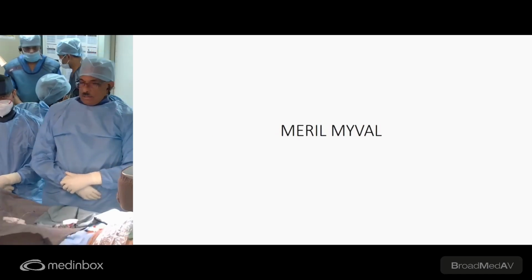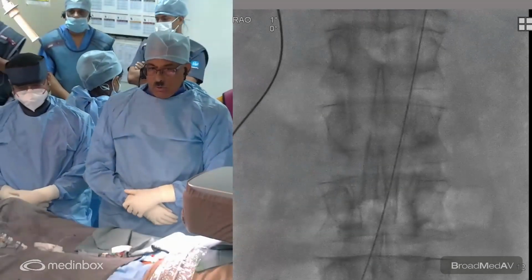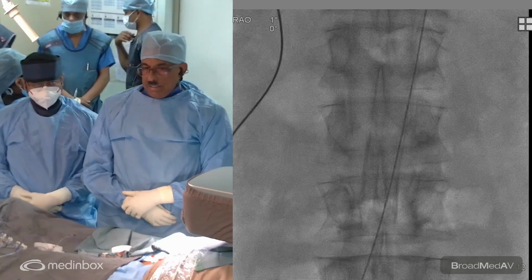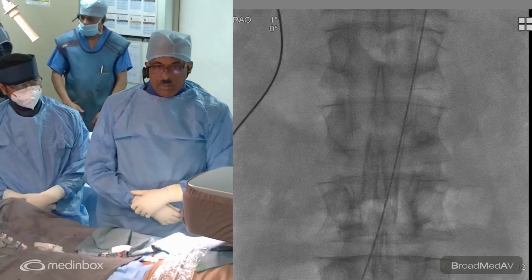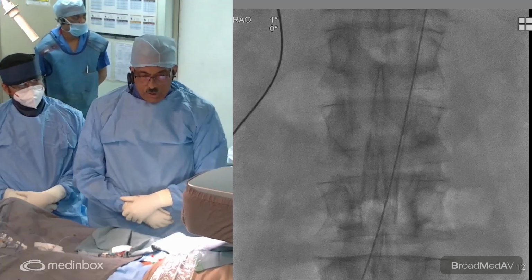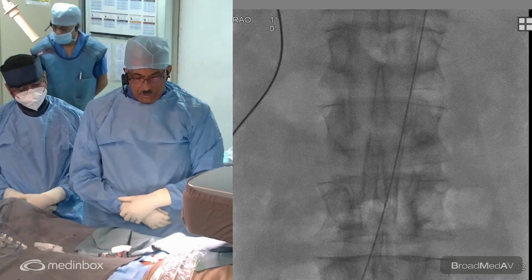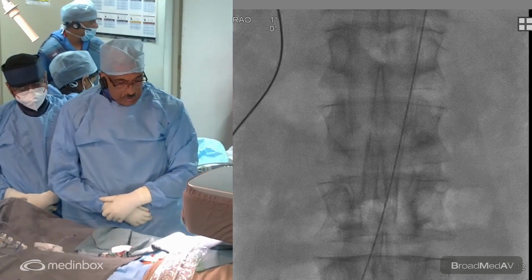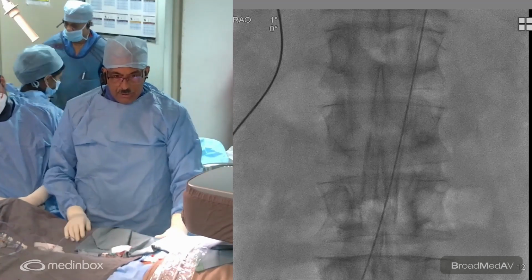So thank you, Nanda. And as he washes into the case, we'll show what we did right now. So the plan is to go ahead with transcatheter aortic valve replacement, with a Meril valve. And the plan is to take accesses on both sides. So both side accesses have been taken under ultrasound guidance, and we have put two 6-French catheters in the left groin and the right groin.